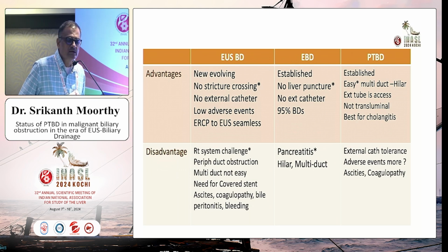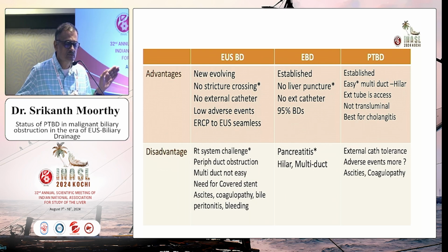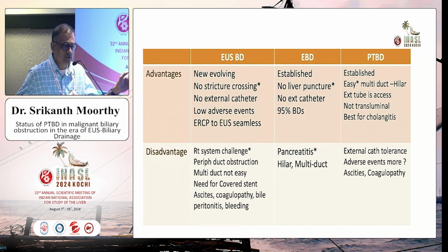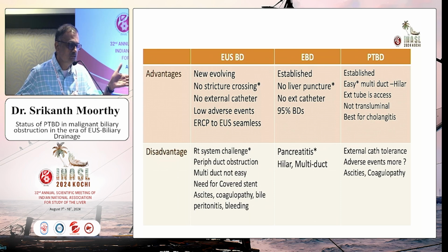So it's a mixed bag, and if you want to put everything in context, I would say that essentially there are some great advantages with the EUS. If you have a failed ERCP situation, the switch to EUS will be very easy. But if you want to, in that situation, drain the right side, you're talking about a much more difficult procedure. And if you want to drain more than one duct, it's particularly problematic in the current situation. Either you have to go bridging from the left to the right, or you will have to use multiple drainages, accessing the right and the left systems. It's not very easy at all.